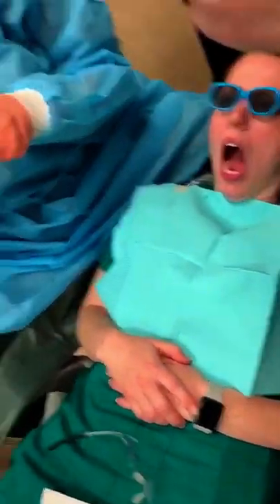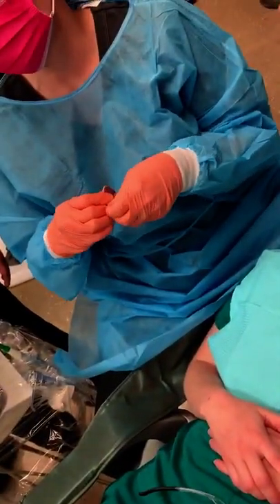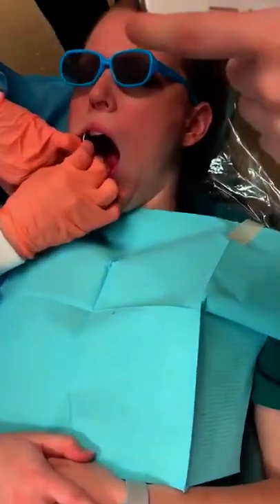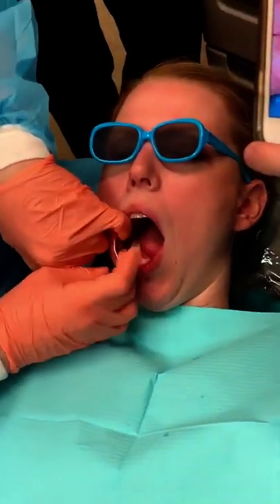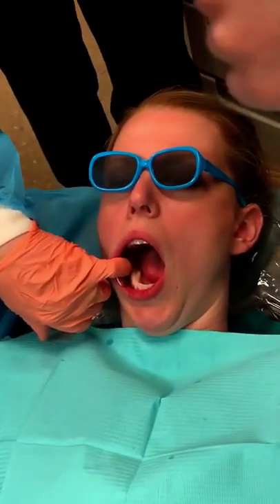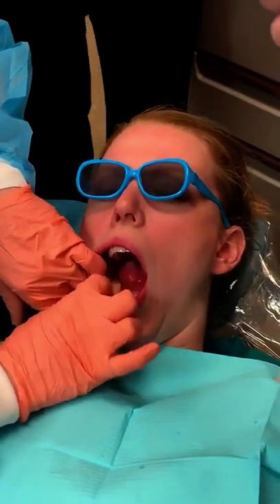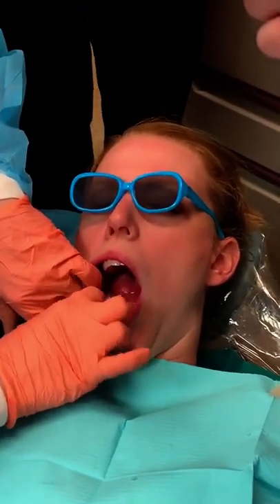I bent this a little bit — if you don't bend it, it can be kind of pokey. So I'm going to stick this right back here to control that saliva. And I'm going to stick a cotton roll on the outside of number 30. Just push it in there; don't be afraid to push it in there. You're not going to hurt them by pushing a cotton roll into their gingiva.